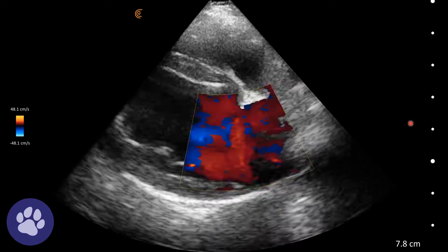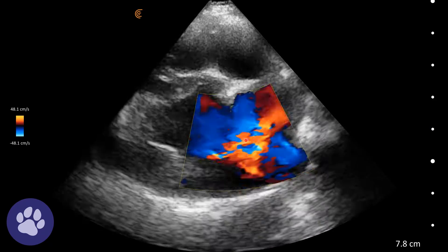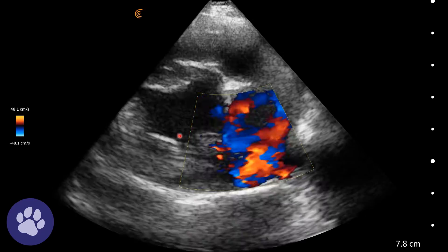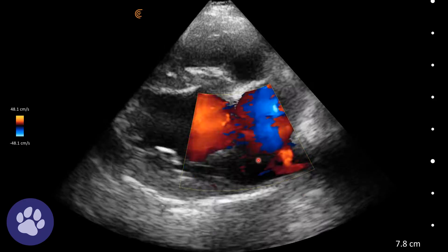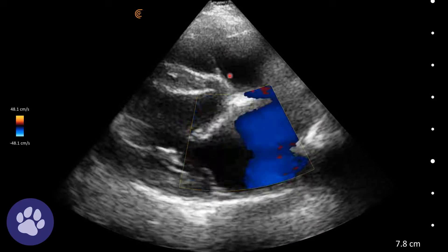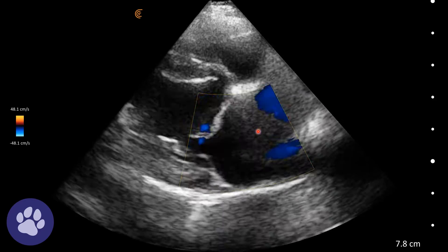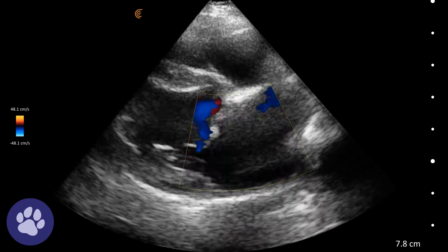We can apply colour flow mapping at this angle where we're expecting flow to go from the left atrium to the left ventricle, and we're looking for regurgitation back into the left atrium. It's not the best angle because we're at a right angle to the sound waves, and colour flow mapping is looking at any flow towards or away from the probe. So it's difficult to see a regurgitation on this view.